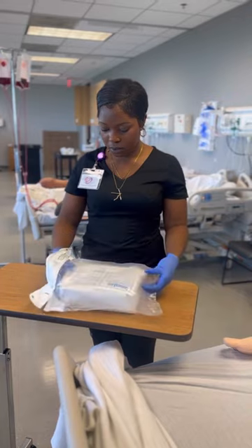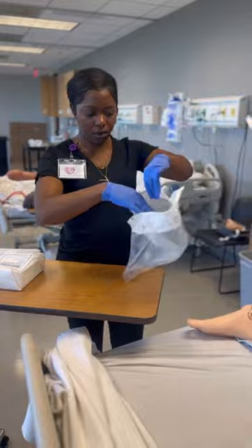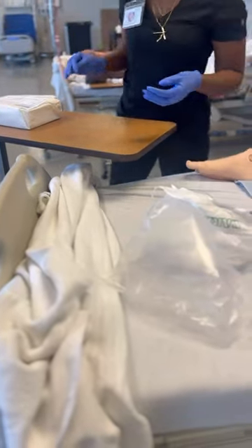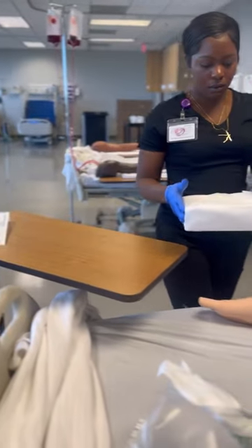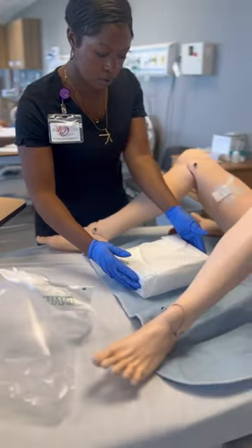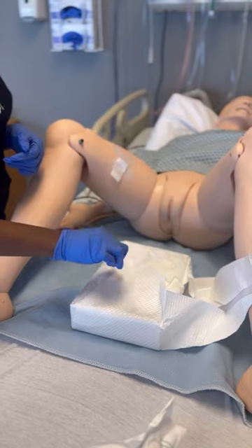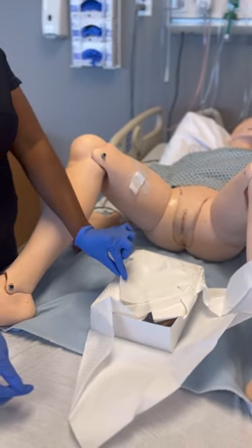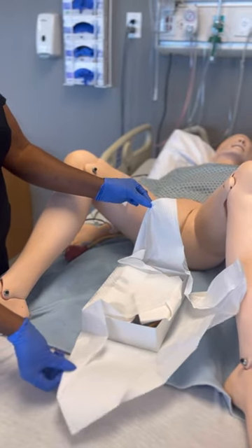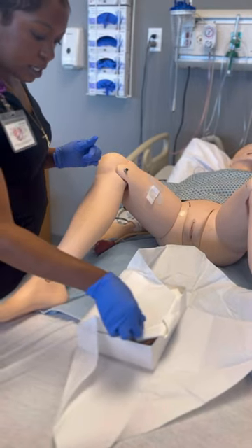Once you've taken your package out of the plastic bag, you have the option to use that plastic bag as a trash bag for disposing of supplies. It's very important to set up your sterile field right in front of you, because if we turn our back against the sterile field, it's considered unsterile. Open the drapes away, side to side, and then the last flap down, setting up right in front of the patient.